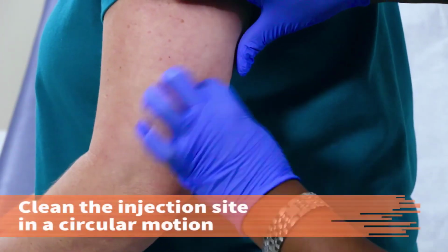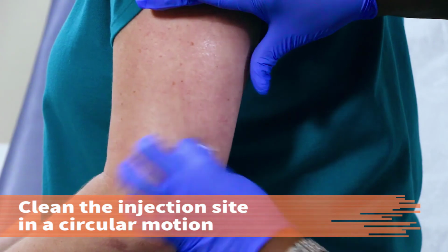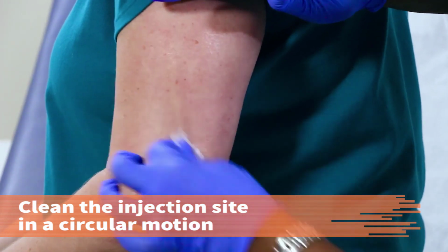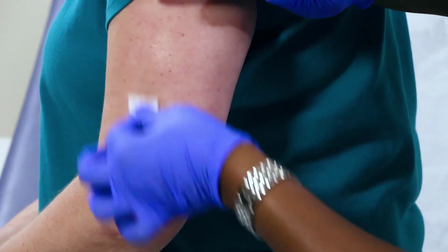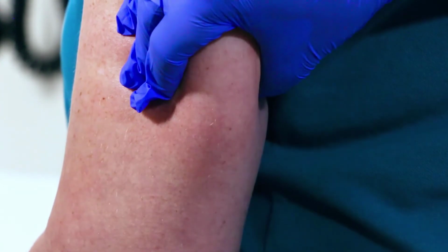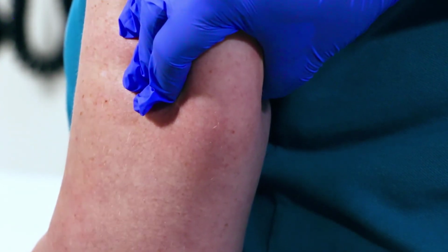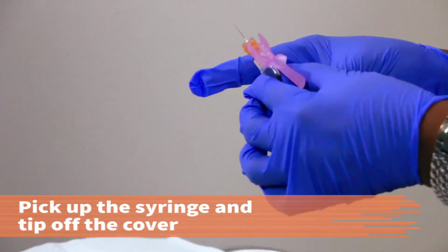Cleanse the patient's skin with the alcohol wipe, using a circular motion and moving outward from the center. Use some friction to help clean the site. Create about a 2-inch circle at the site. Let the site dry. With the index finger and thumb of your non-dominant hand, pinch up the skin at the cleansed area. Pick up the syringe and tip it to remove the cover.